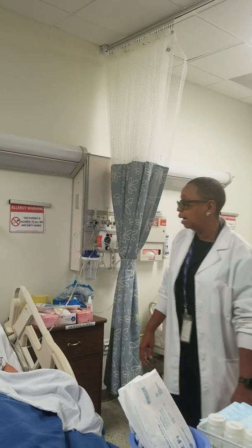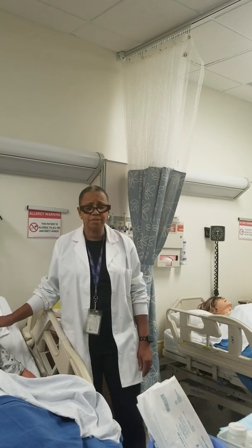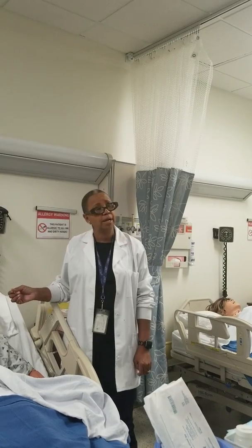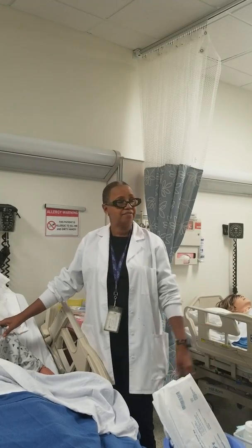Okay. What else do I need to do before I do anything to him? I can listen to his lungs. I'm going to tell him a little bit about what I'm going to do. They have a trach. They've probably been suctioned before. Okay. I say, I'm in here. I'm going to do your trach care. I might have to suction you out. How you doing today? You know, nod your head if you're doing okay.